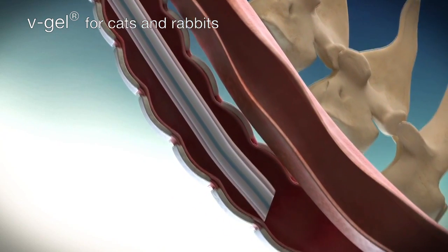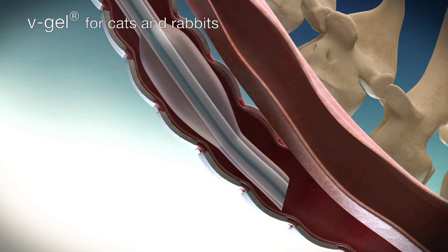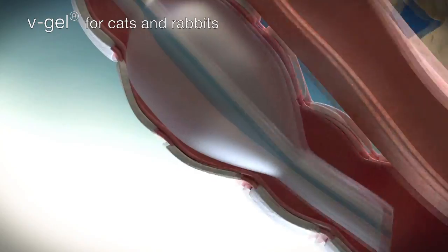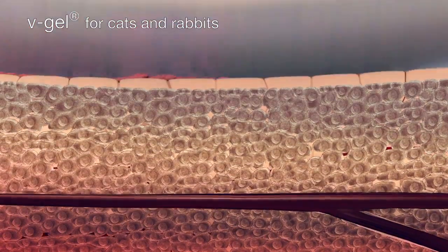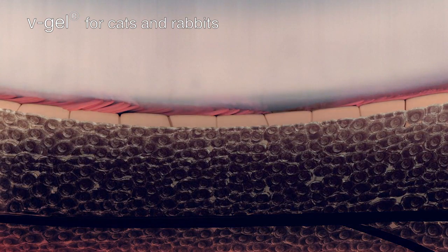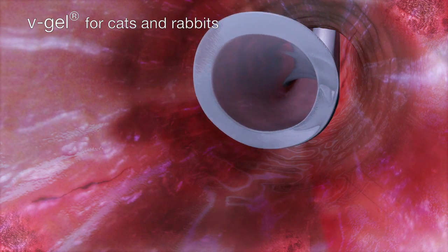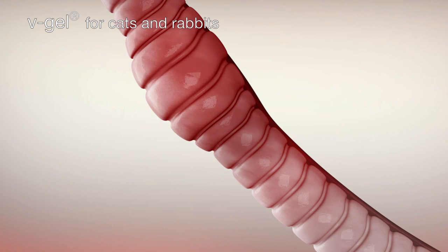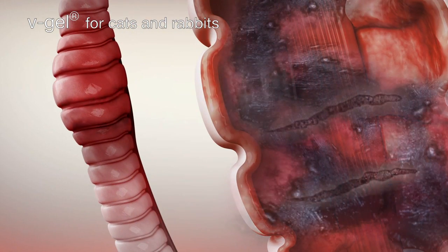Many endotracheal tubes have an inflatable cuff. This cuff is designed to press against the tracheal wall to seal the airway during ventilation. The process of cuff inflation can unfortunately compress mucosal vessels. Compression of the blood supply can result in extensive mucosal necrosis. This might result in anything from throat pain and an increased risk of infection to a complete tracheal rupture.